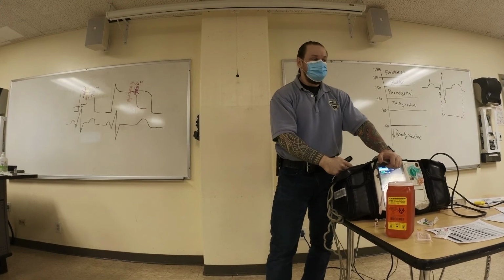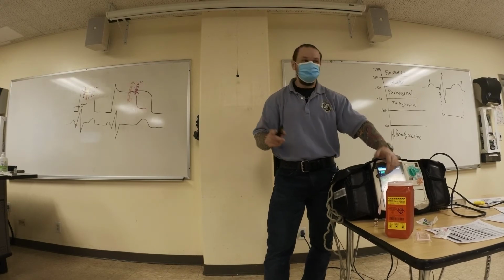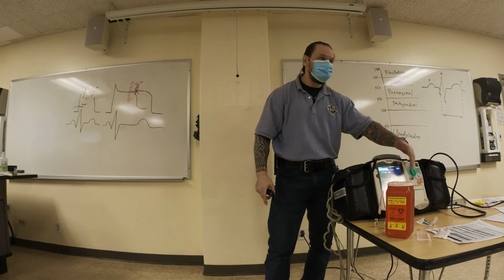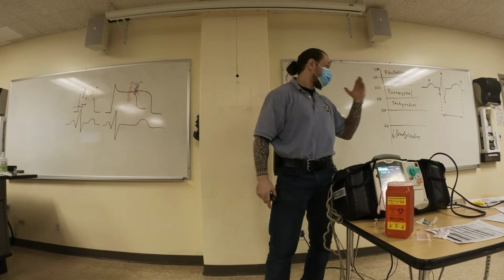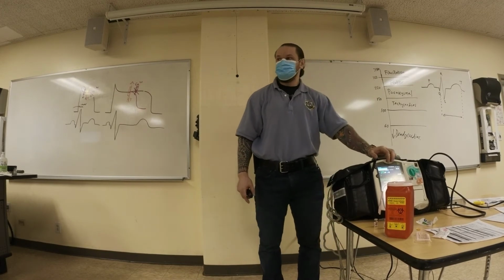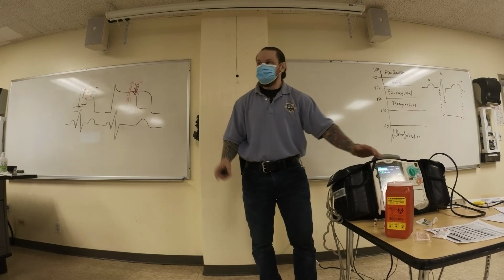Defibrillating torsade, will it ever convert it? It will convert it. And the problem is this: if it's sustained, you may go into VFib, or you may lose pulses with a sustained paroxysm. That's prolonged. So you're still starting with 100 joules.